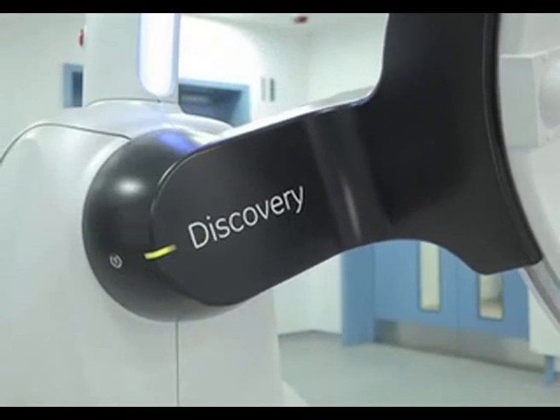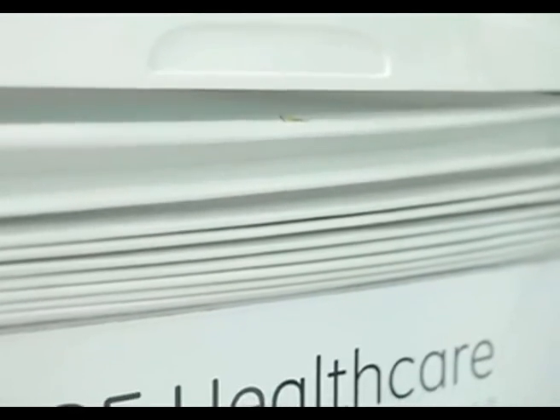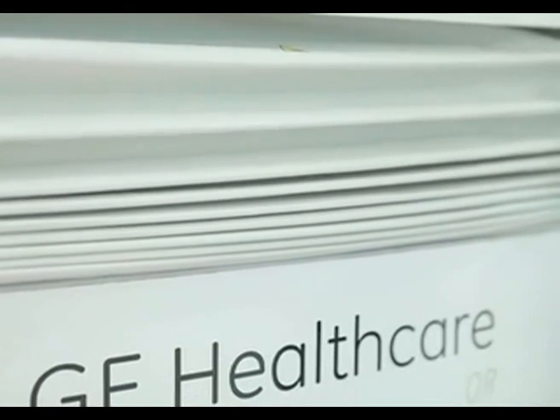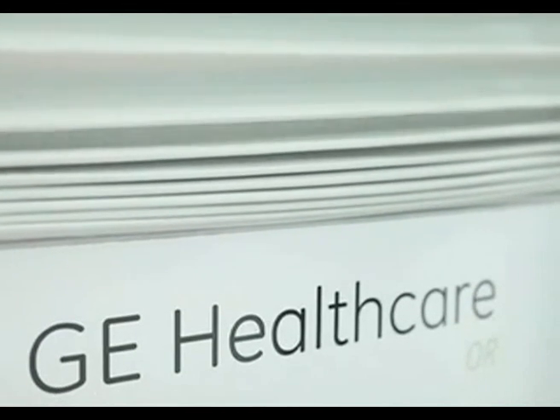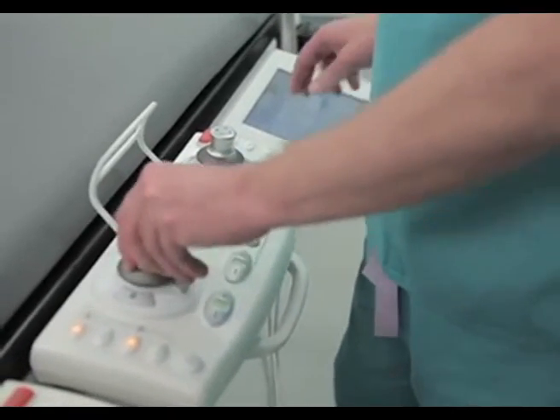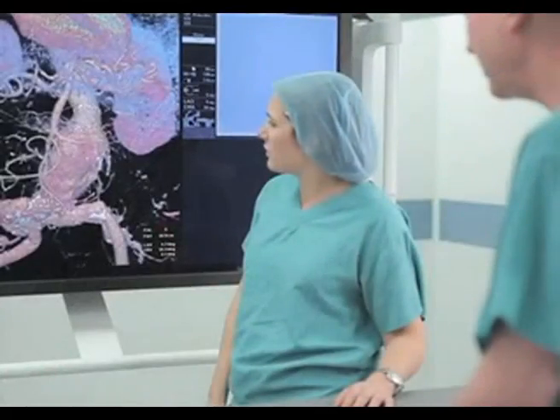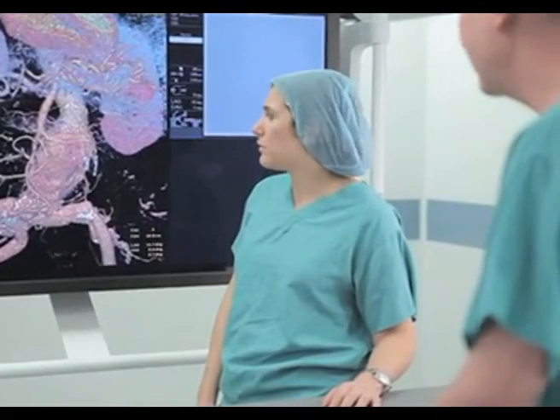The GE Discovery 730 has been developed with endovascular specialists. It has a very simple registration setup to create fusion imaging. The workstation of the system is used to upload images from the hospital system. These are then merged with images created on the table, and this can be done with a few clicks of a button.